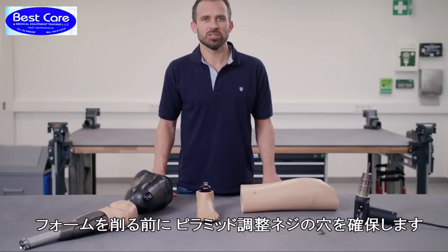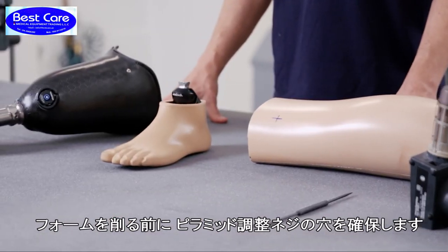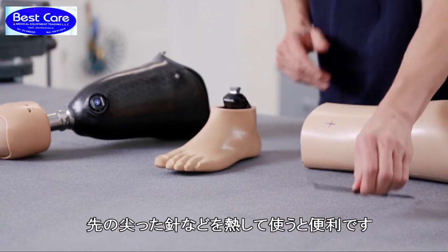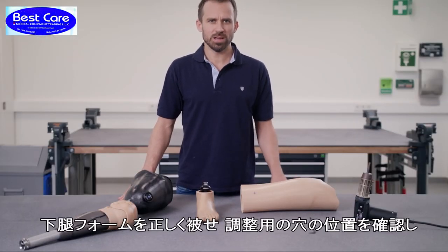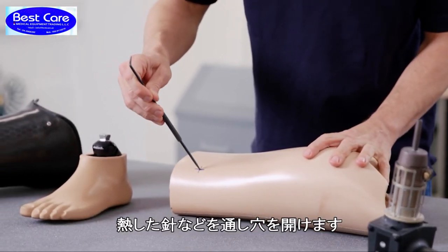Before you start sanding the shape of the shank, you must ensure that you can access the screws. It's best to use the scribing needle heated with hot air to do this. Pull on the shortened shank, determine the height of the access holes, and push the hot scribing needle through the foam.